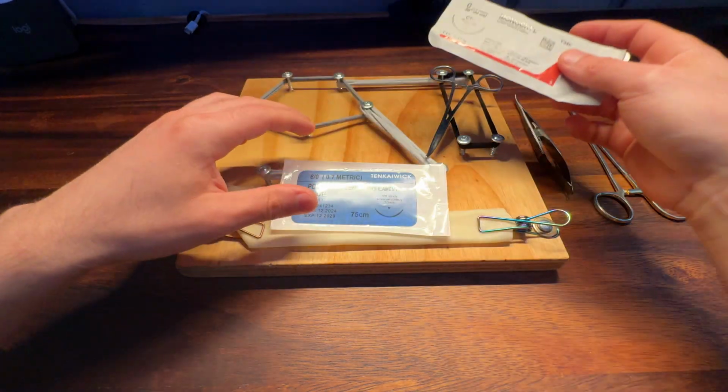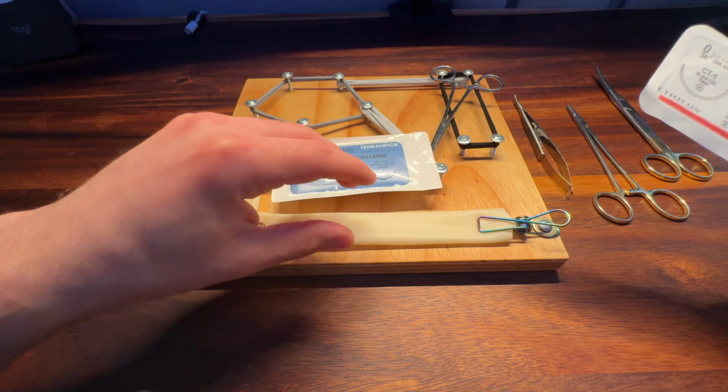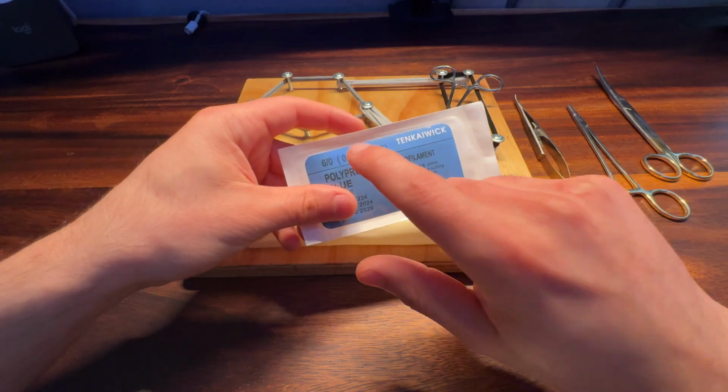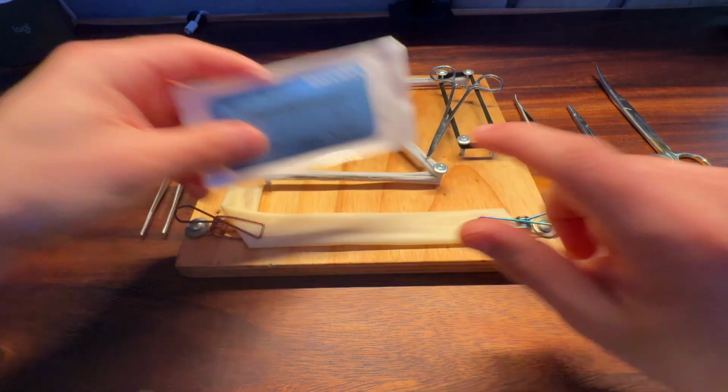But in this situation, you actually want something a little bit more permanent because you don't want anything to come apart in the blood vessel. So that's why you use a non-absorbable, that's monofilament, okay?